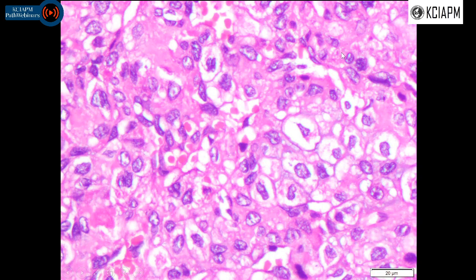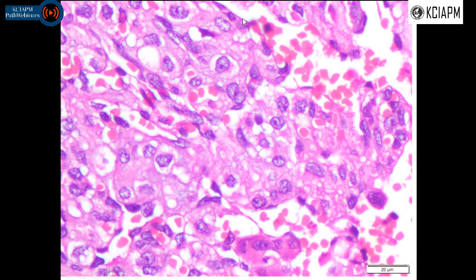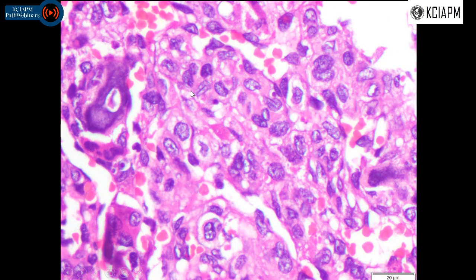We have the chondroid matrix where the chondroid cells are polygonal and some of them elongated, and many have an insignificant or not a very obvious cleaved nucleus. Here the cleaving is very well seen in this slide.